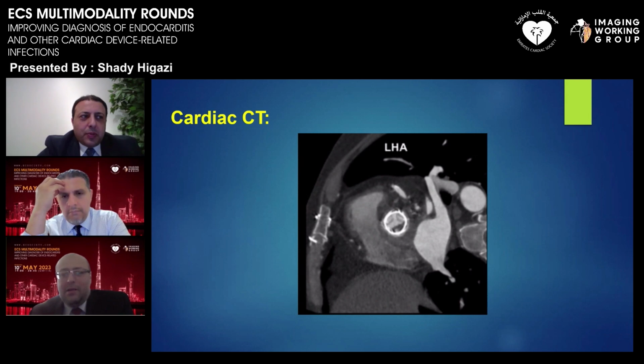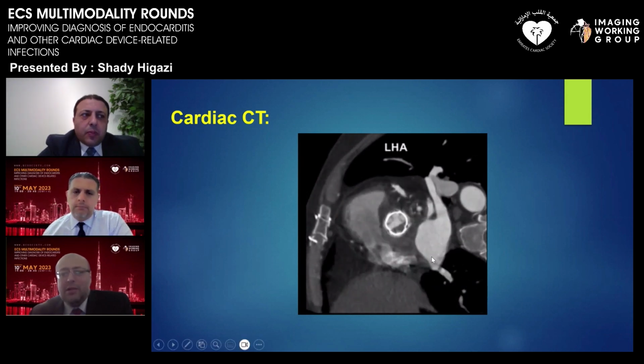So the surgeon, first of all, wants to know the extent of the infection. How far does it go in the LVOT? How far does it go up the aorta? That's going to be another helpful piece of information that you get from FDG PET, because most likely this will require a whole root reconstruction in addition to the valve. So the LVOT, valve, and root reconstruction.